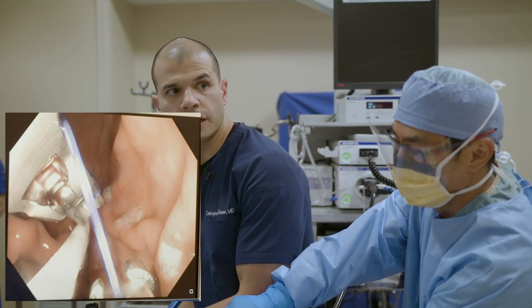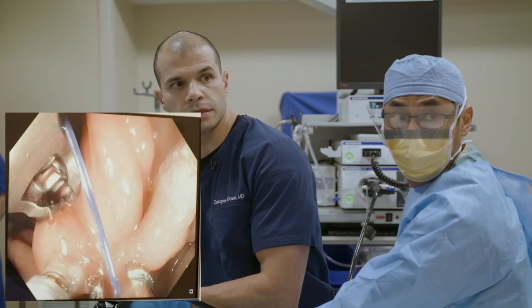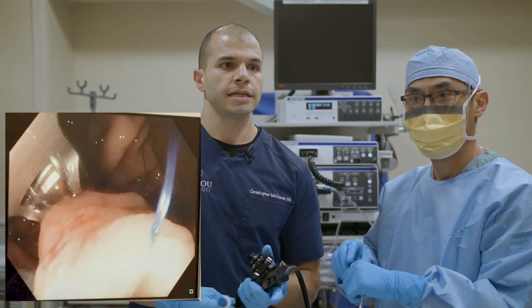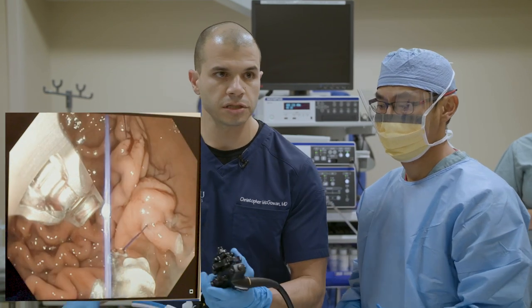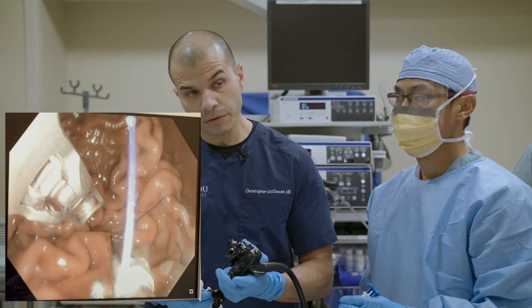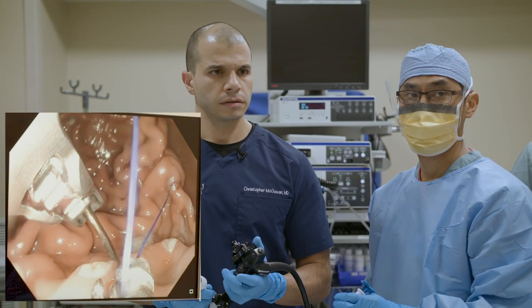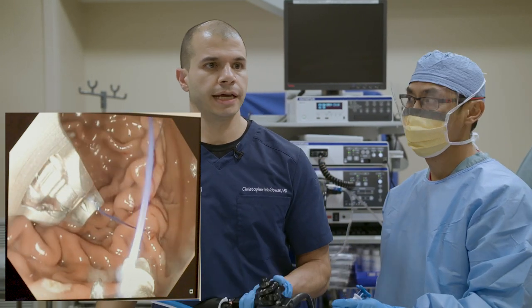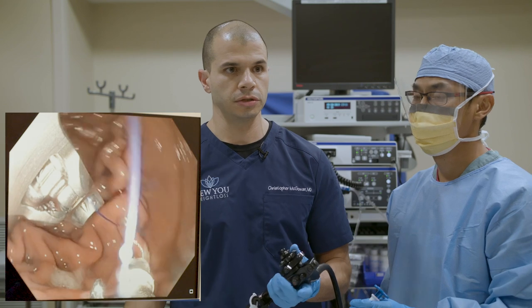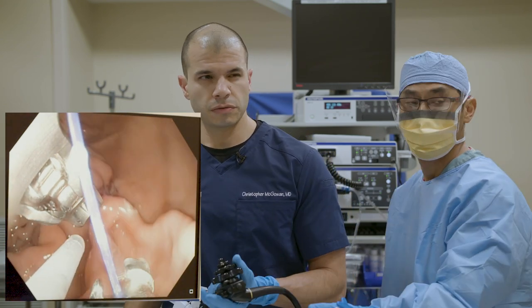After the first couple of days, it's more a matter of fatigue from the low-calorie diet our patients follow initially. Every time I close the handle and pass the needle through, I'm making sure I'm all the way through — I get feedback from the device, almost like a crunch, that tells me I'm deep enough and that suture is not going anywhere. If we're not deep enough, the suture will pull into the stomach and loosen over time, potentially leading to failure.